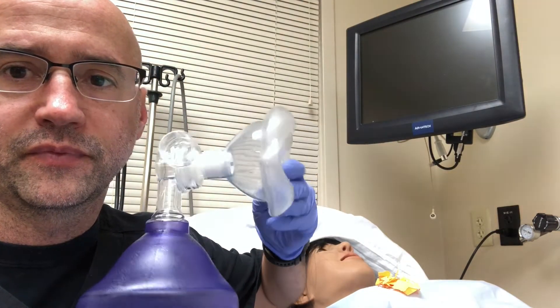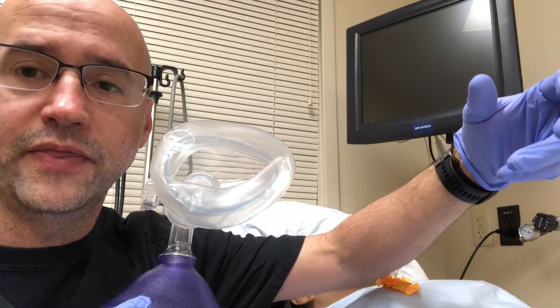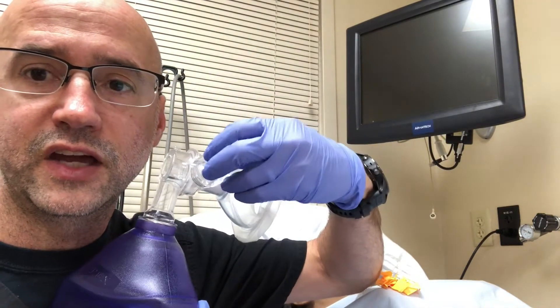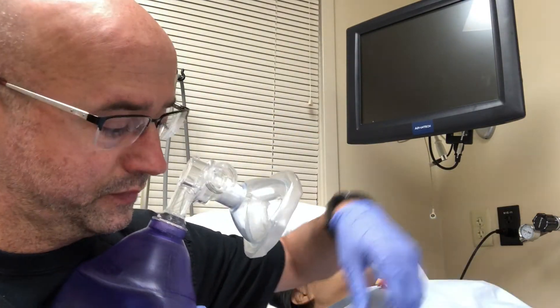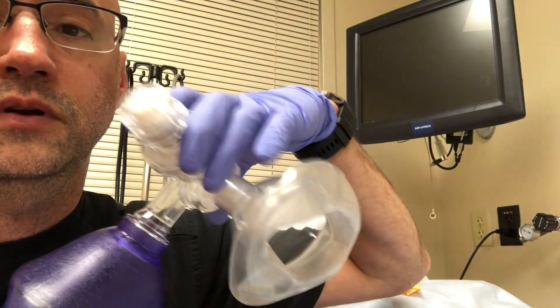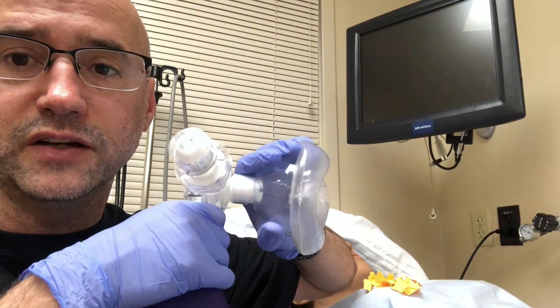So on the BVM, we all know the air comes out right here. And then when a patient breathes back in, it goes back into the mask and then shoots out this port. If you put a PEEP valve on this port, it does change the pressure, but air still comes out.